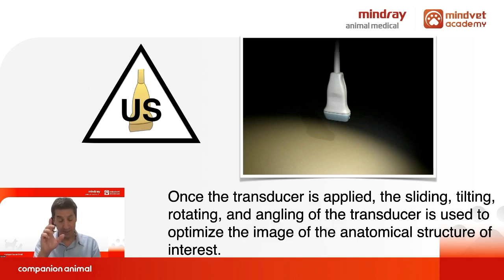However, and pay attention to this tip. However, we need to align the needle with the ultrasound beam. It should be parallel, because if not, we will not be able to see the needle. If we tilt our probe to get a nice picture, we won't be able to see the needle because the needle cannot align with the ultrasound beam.